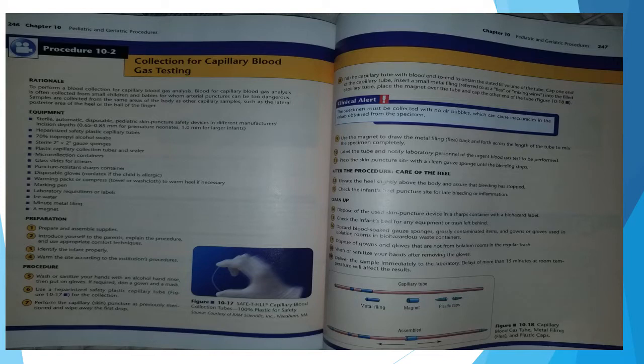10.2 Collection for capillary blood gas testing. Rationale: to perform a blood collection for capillary blood gas analysis. Blood for capillary blood gas analysis is often collected from small children and babies for whom arterial punctures can be too dangerous. Samples are collected from the same areas of the body as other capillary samples, such as the lateral posterior area of the heel or the ball of the finger.